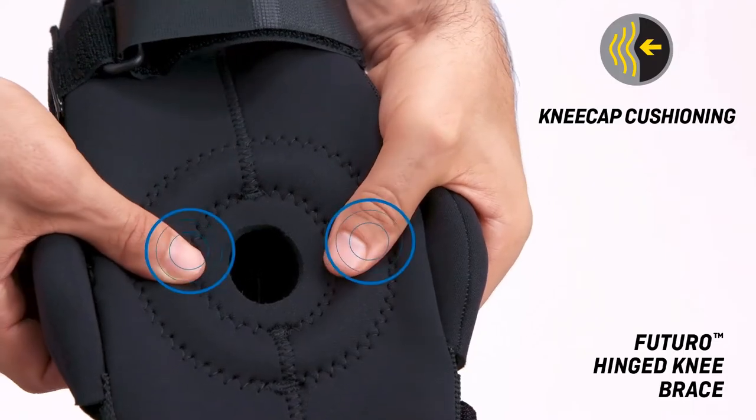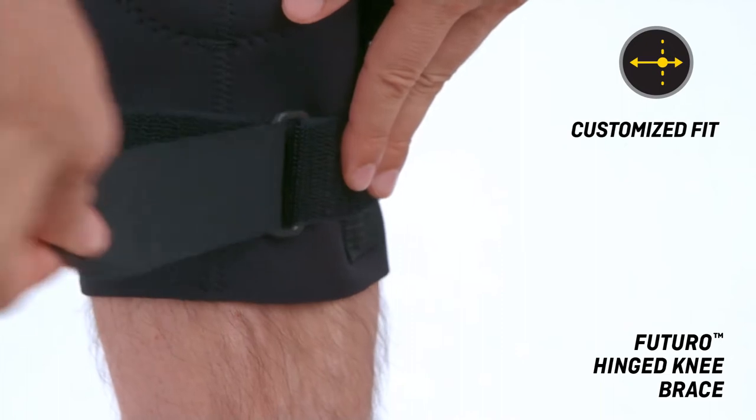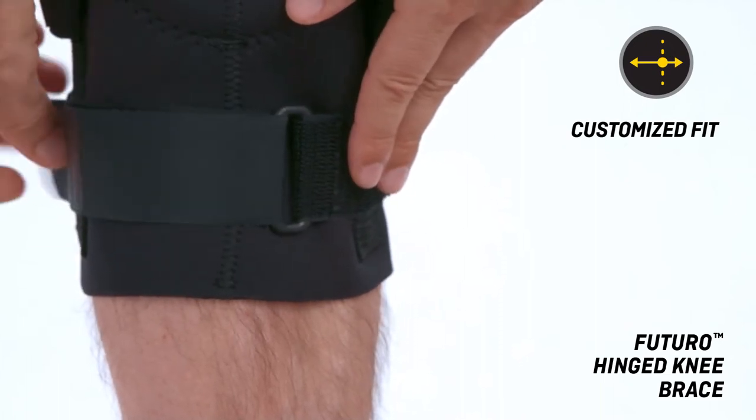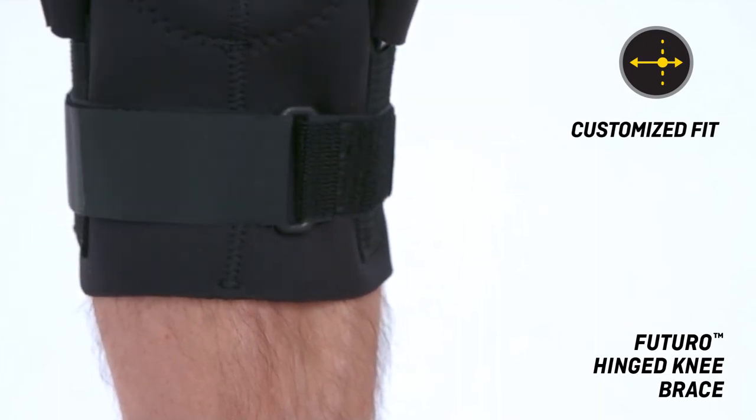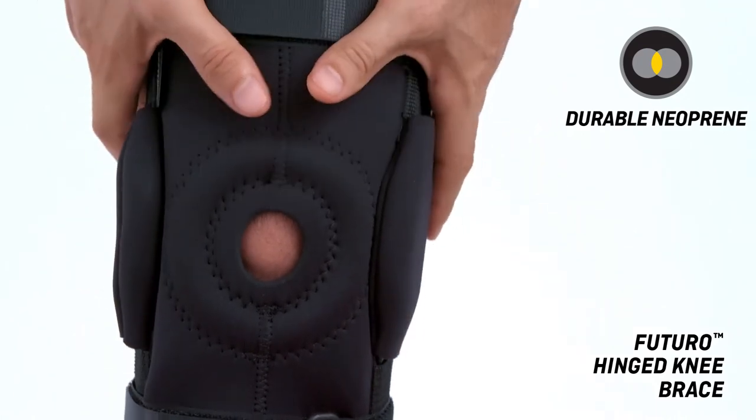Kneecap cushioning provides stability and protection. Cinch straps provide adjustable support and a customizable fit. Durable neoprene blend provides strong support, warmth, and comfort.